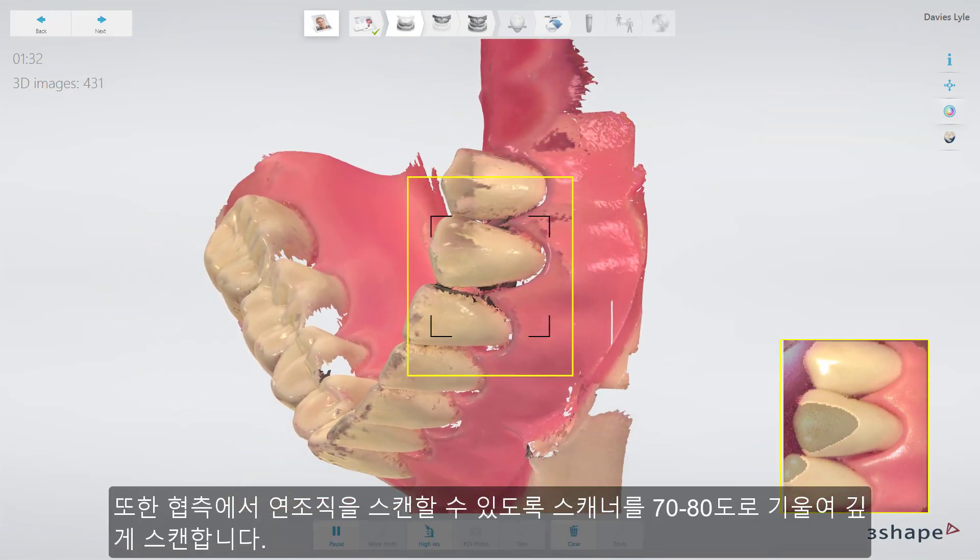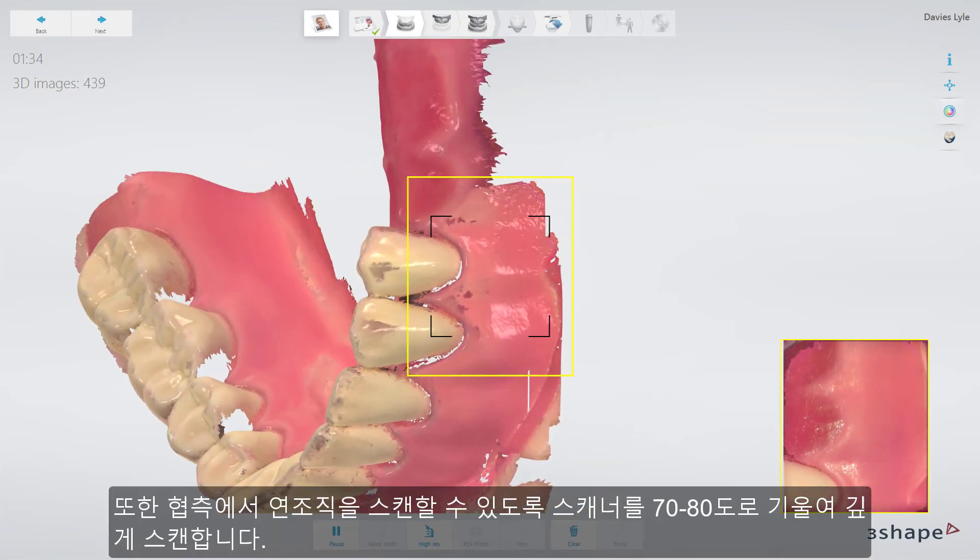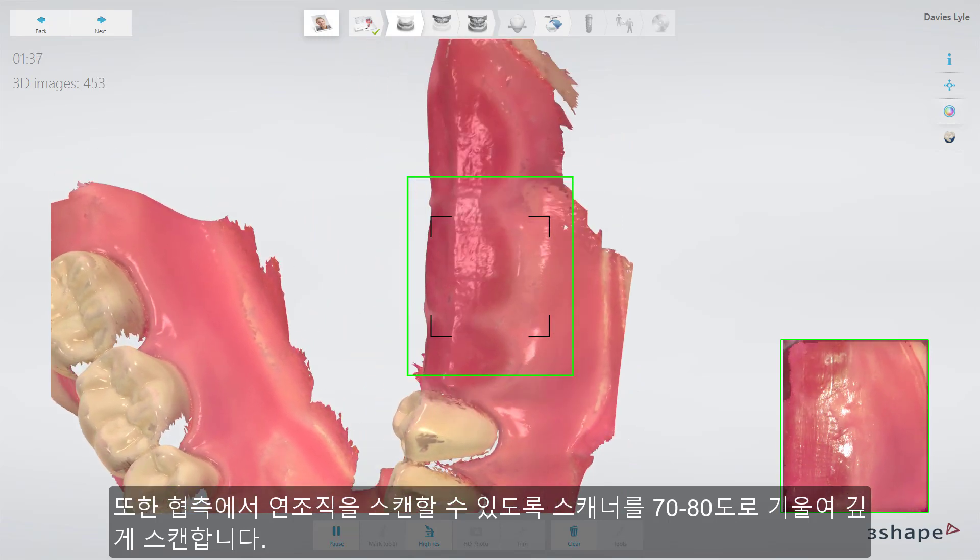On the buccal side, also try to go as deep as possible, with a 70-80 degree angle, to cover the soft tissue.